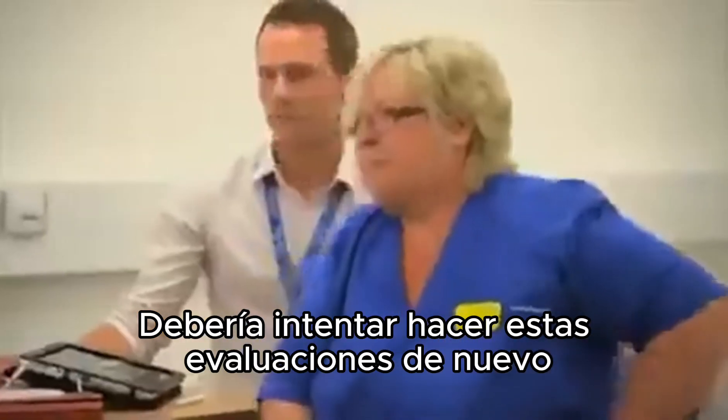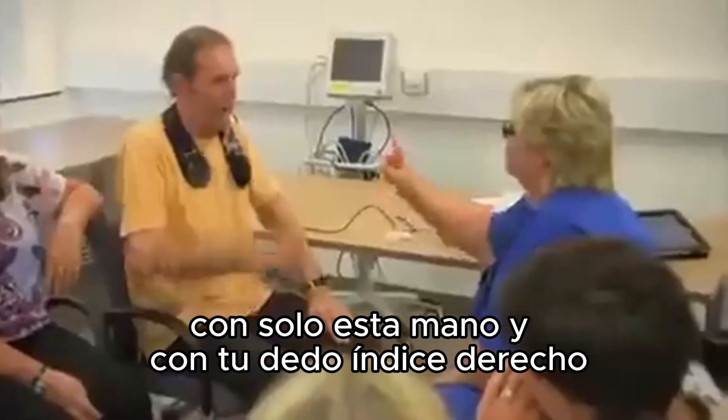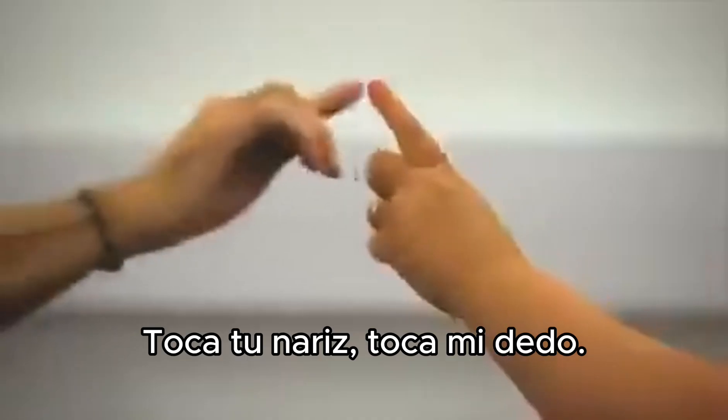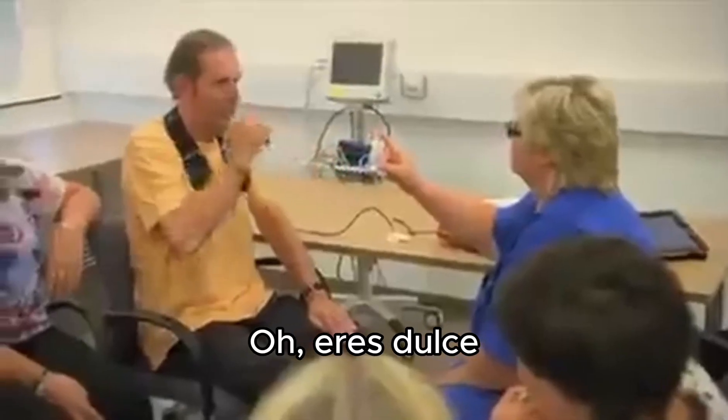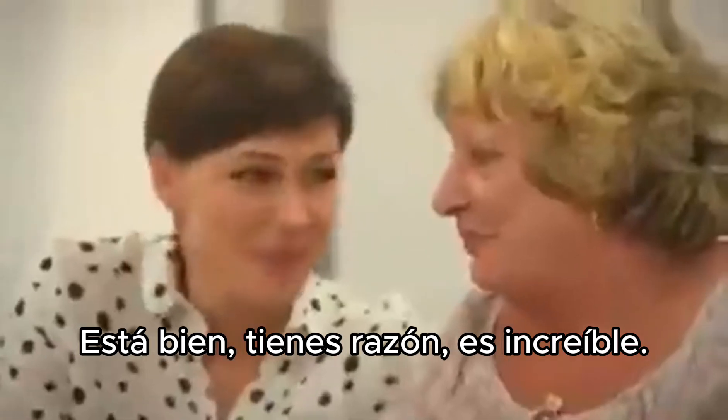Shall we try and do these assessments again? With this hand only, and with your right index finger, touch your nose, touch my finger. OK, you're all right. It's amazing.